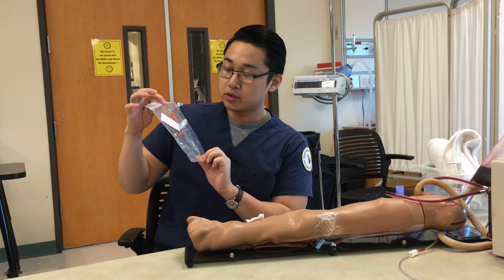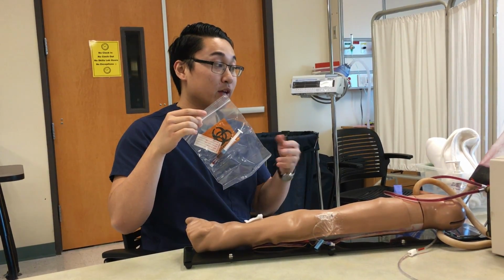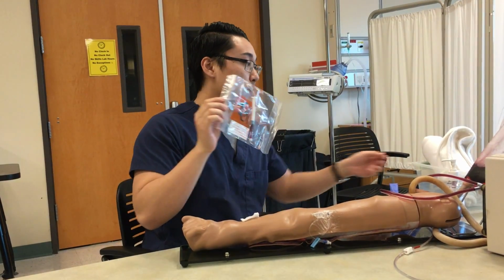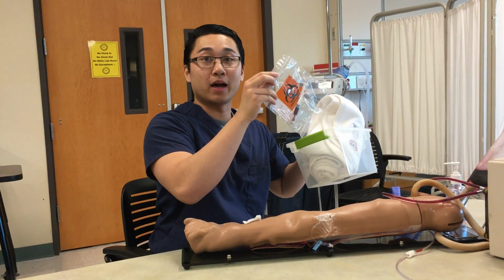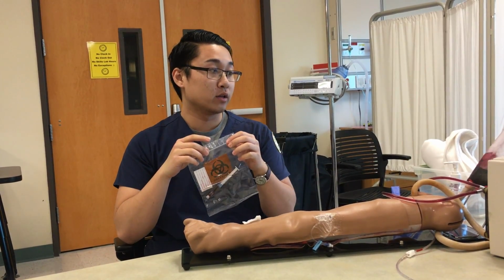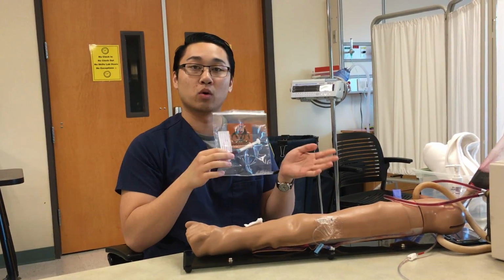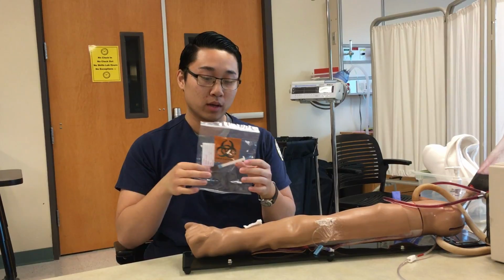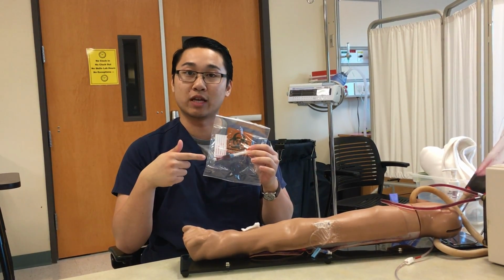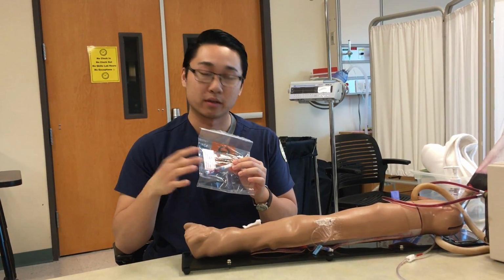So if in my arrangements I know I cannot do the testing within 15 minutes, I will put it into the ice bath or the ice slush. And if I don't test this within an hour, I have to redo the whole sampling. I have to get a new sample because this sample is no longer good. There's too much metabolization that went on, and it will give me an inaccurate reading.